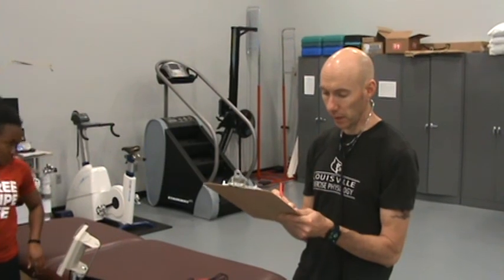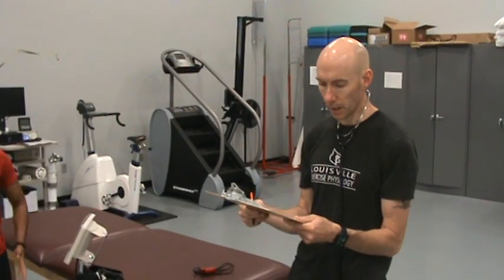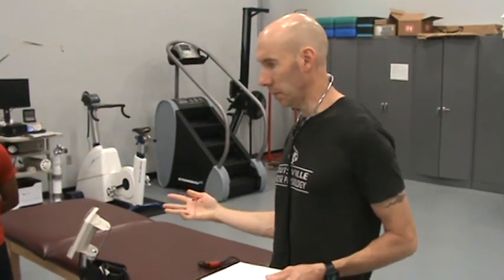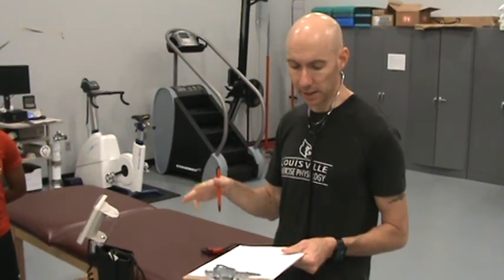Jumped up quite a bit from the seated, which is not to be unexpected, to be honest with you. Okay. What we typically will see, now this doesn't always happen, and it hasn't necessarily happened with Lindsay either, but these numbers should increase as we move from supine to seated to standing. Heart has to work harder to return blood back up to the thoracic cavity in the head. When somebody's in a standing position, gravity is pulling the blood flow down, so the heart is gonna have to work harder, beat faster, increase pressure, so that should drive the numbers up as somebody goes from supine to seated to standing. When somebody's supine, gravity does not have as much of an effect, so the heart doesn't have to beat as fast, and there is less pressure in the system because it's easier to get blood back up to the heart and the thoracic cavity.